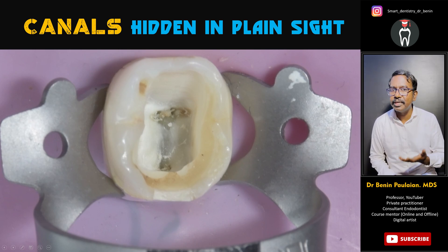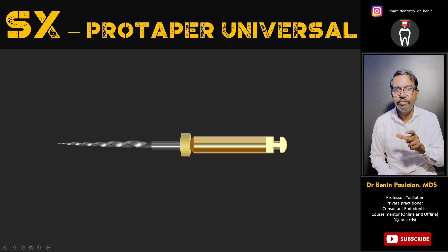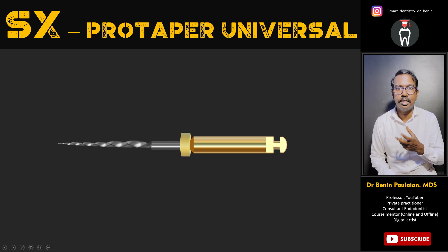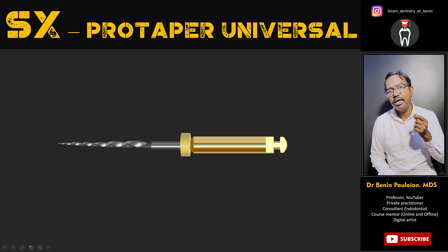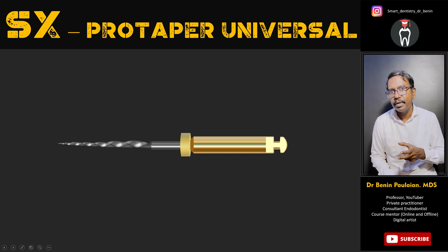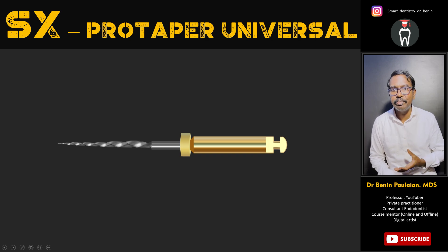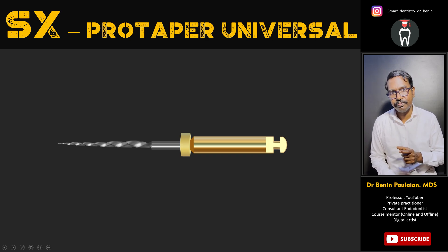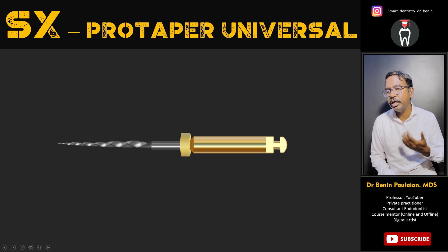Why use ProTaper Universal? Because the SX file is quite short — 19 millimeters — which is essential. We must use ProTaper Universal and not ProTaper Gold, because ProTaper Universal is stiffer compared to ProTaper Gold. If you use ProTaper Gold for this purpose, you may end up with instrument separation. Once the instrument is inside the orifice, go only four or five millimeters. Do not push the instrument deep inside — it might separate. Use it only as a tool for locating and enlarging the orifice, then proceed with regular cleaning and shaping.